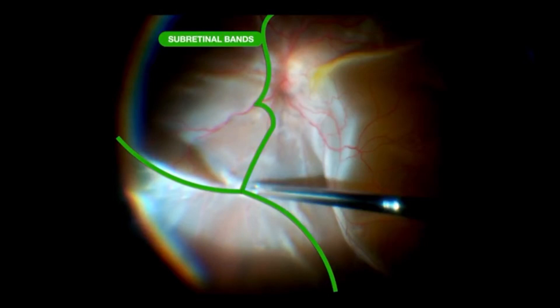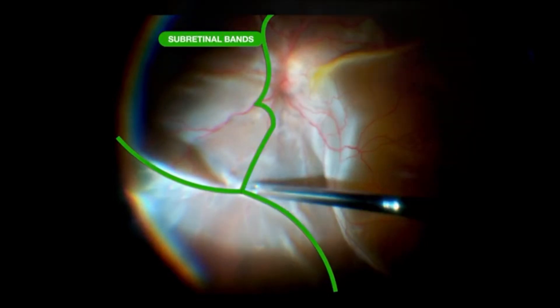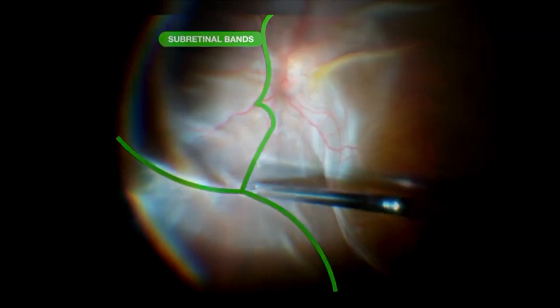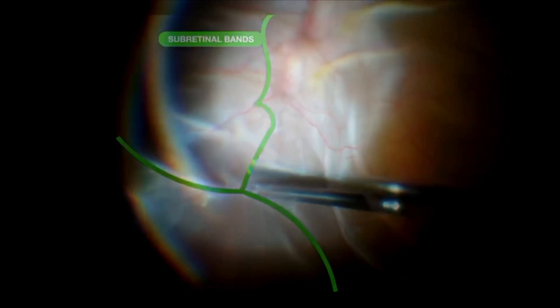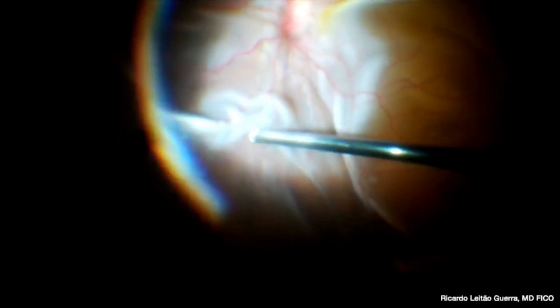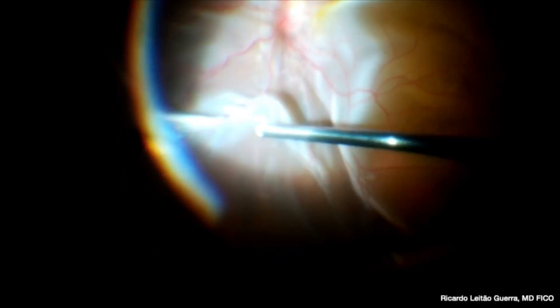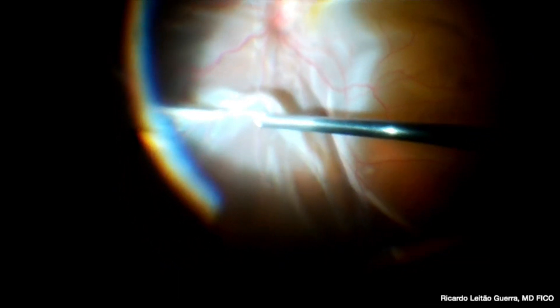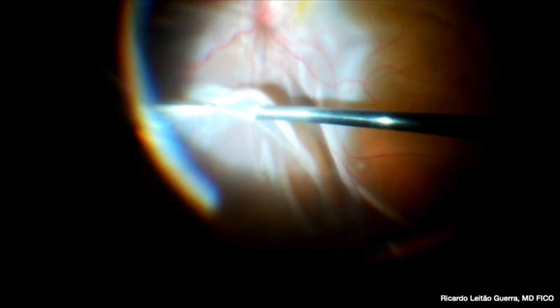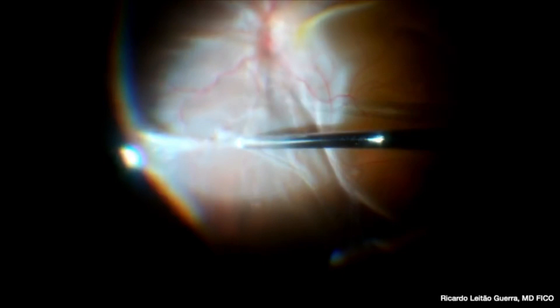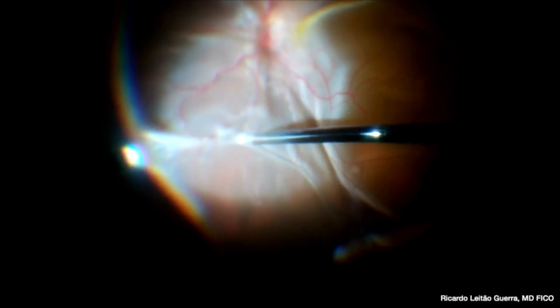First of all, the surgeon needs to identify those membranes that will prevent reattachment and plan which subretinal bands need to be removed. Sometimes you need to place a perfluorocarbon liquid bubble to identify those membranes that will prevent flattening of the retina and that need to be removed.